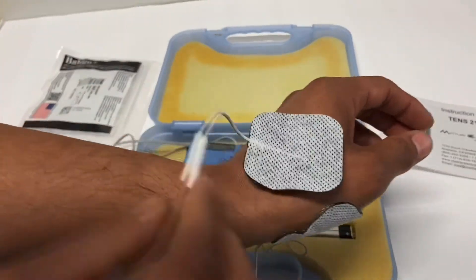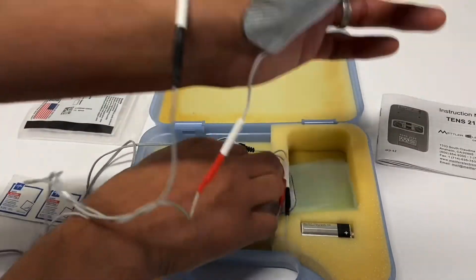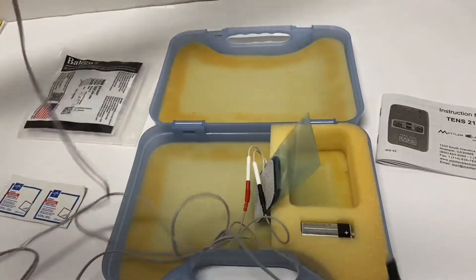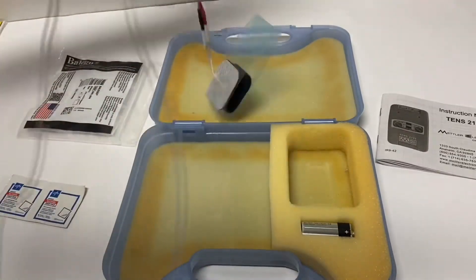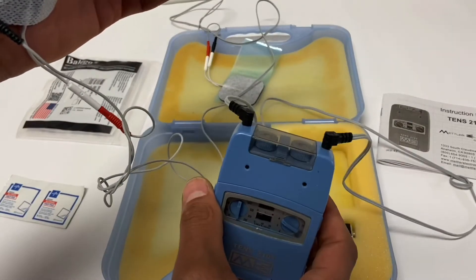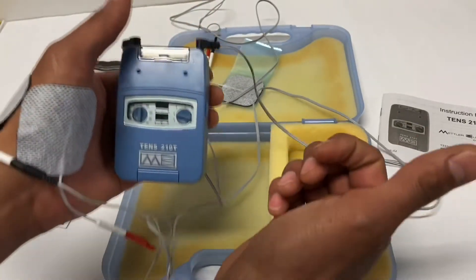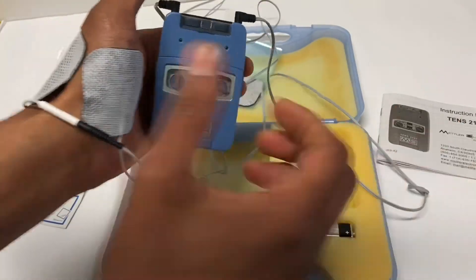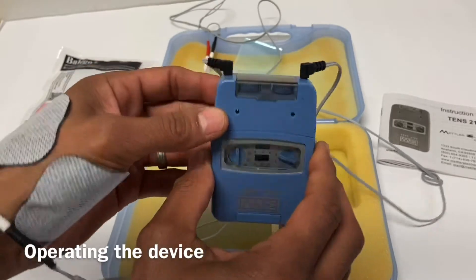With TENS you can use one or two channels — you don't have to use both, but you can. Each channel works exclusive of the other, so if you wanted to use one on your left hand and one on your right hand you could. This is different from IFC, where the four channels need to work together.